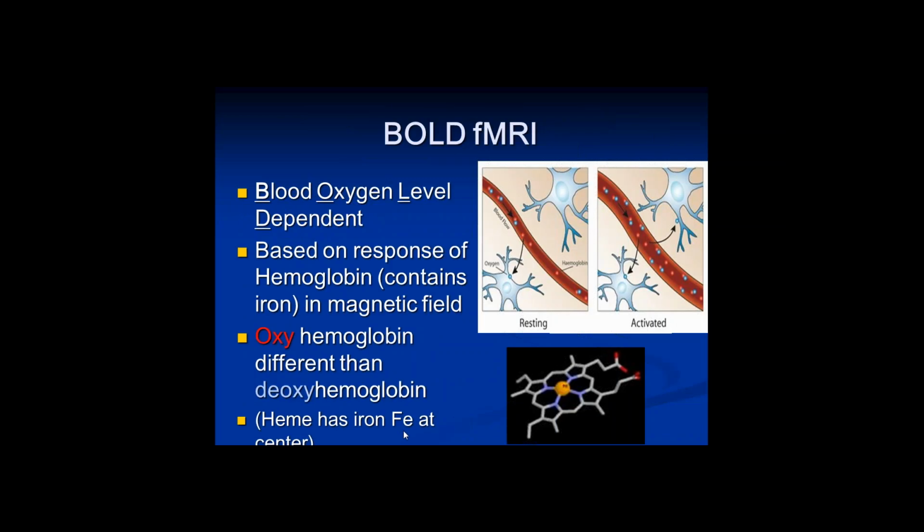So what's the BOLD method? BOLD is an acronym, and it's the most common method I've seen published for functional MRI, so that's why I'm going to review it briefly. It stands for blood oxygen level dependent, and that's a very good acronym because it describes what it's doing. If you zoom in on the tiny brain cells in a region of the brain where you want to see functional activity, in the capillaries the oxygenated blood is nice and red, and the deoxygenated blood is blue.